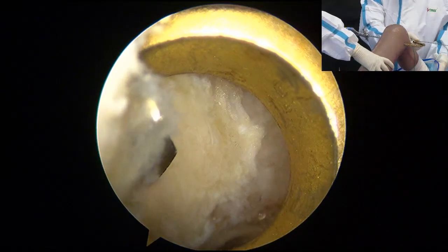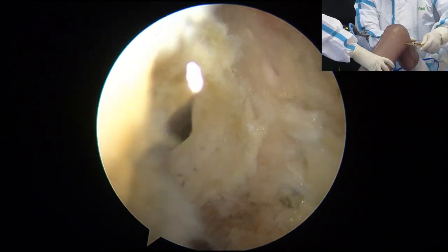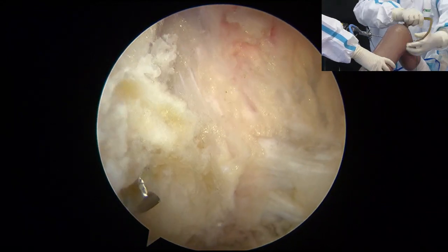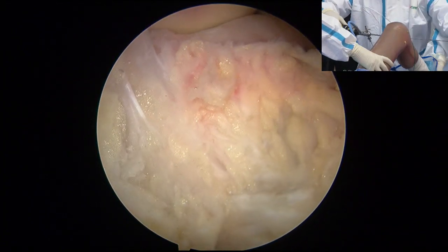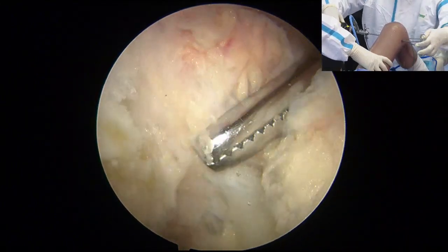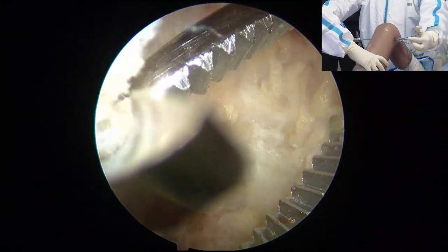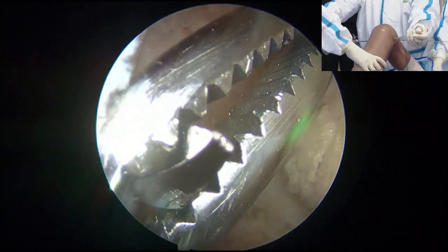You need the sharp pin because a sharp pin will not slip. Okay, careful doing the PCL. If you do not use the sharp pin, it can slip off the cortex. 那做PCL的隧道呢，最好是用比较尖的导针，不然呢，容易偏向。Okay, here and then I protect the tip of my pin. 然后用 cocker 钳去保护导针的针尖。Okay, protect it. Okay, reaming.